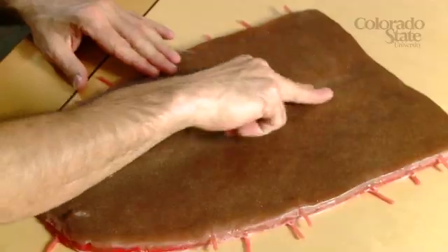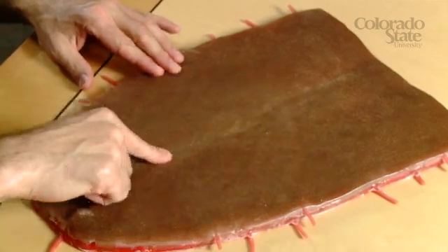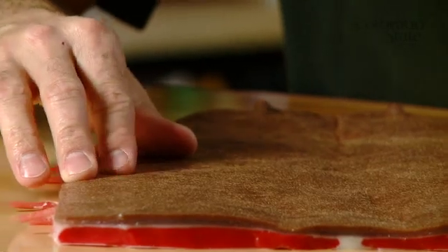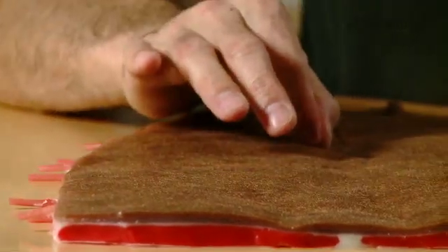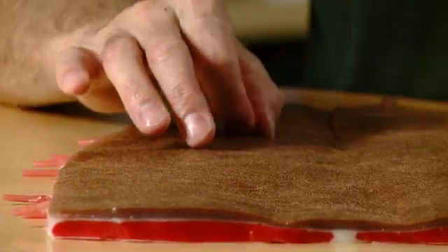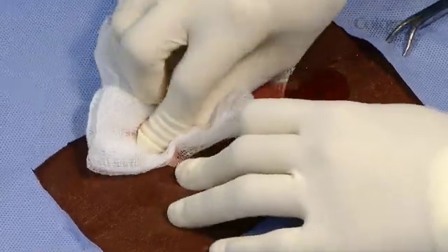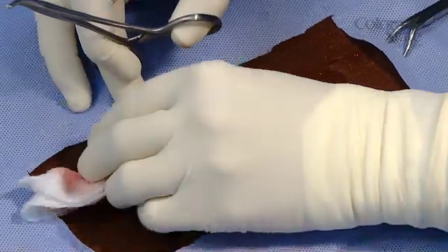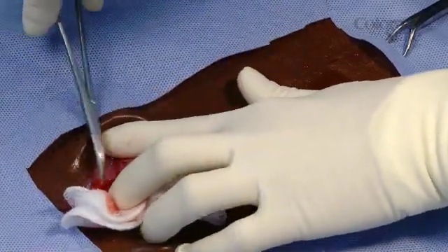The midline in the real horse would be the linea alba, so you don't have any vessels going across. The goal here is to have the student create an incision, and if they create an incision off midline, they're going to have to deal with the vessels that are inside the muscle, which is something that they would have to do in a real situation as well.